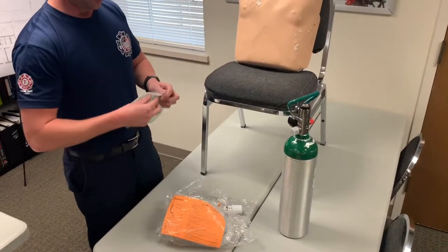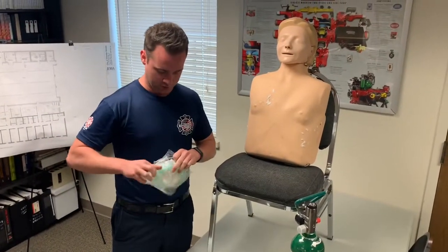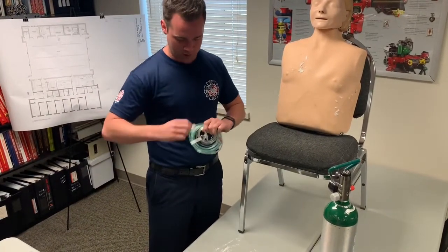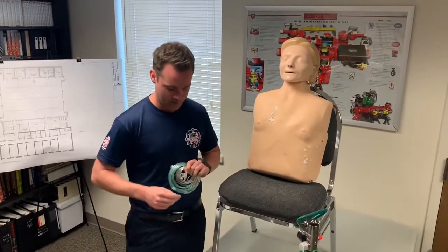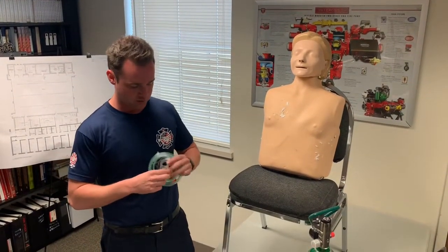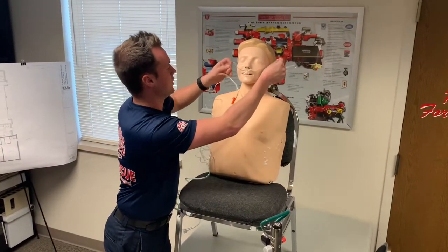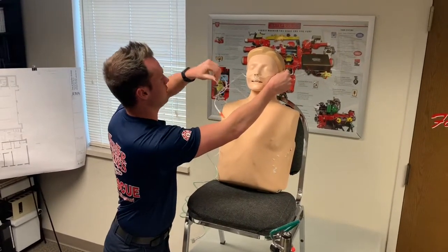The first thing you want to do is obviously explain what you're doing to the patient. Most of the patients we run have had CPAP before and can tolerate it. If patients can't tolerate CPAP, protocols do allow us to try a low dose of 1 milligram of Ativan, try to relax them and they can tolerate better. It does cause a little bit of claustrophobia, but we'll want to apply the end-tidal nasal cannula first. That way we can monitor respirations and end-tidal once we put the CPAP on.